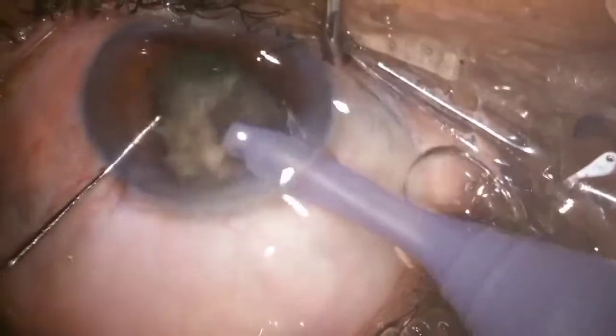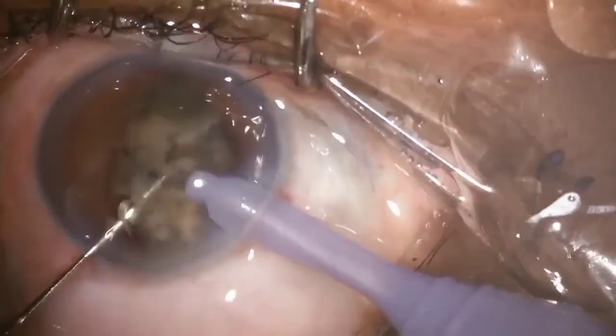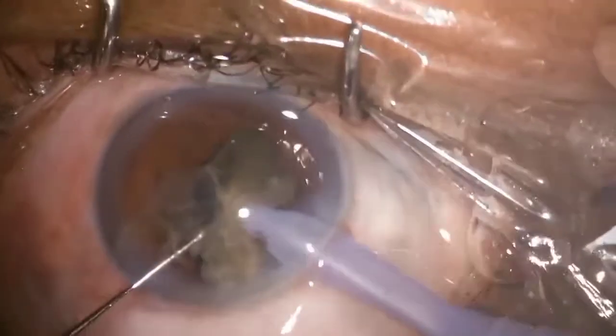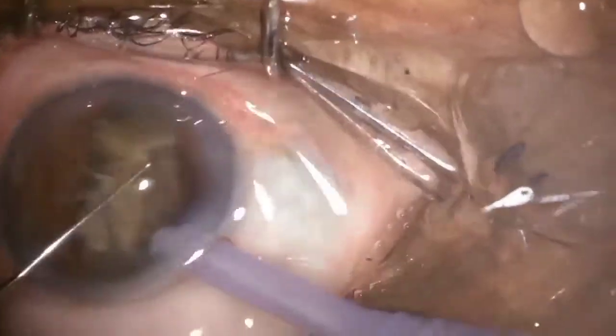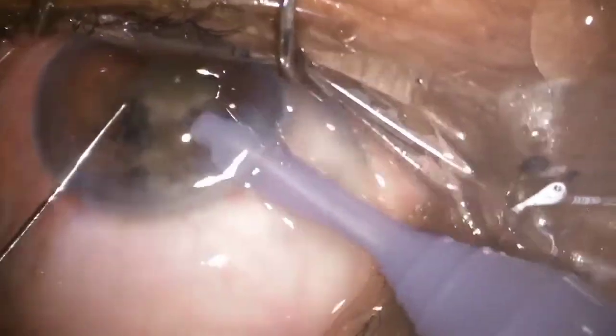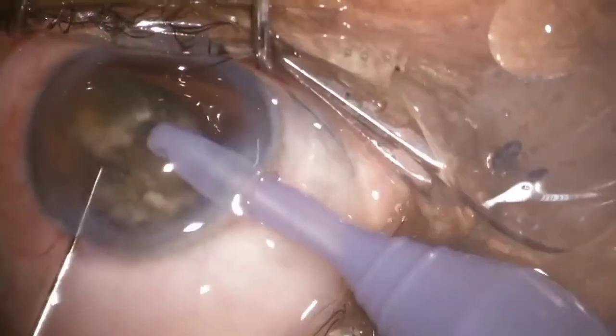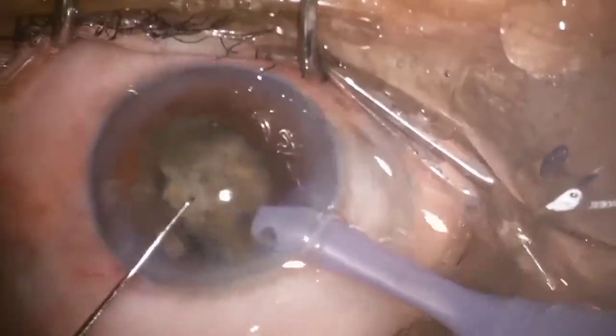I decided to do it very slowly. Slowly, I decided to crack the nucleus in the AC, and very slowly, I decided to do the Phaco in the AC. As I was applying more Phaco energy in the AC, the pupillary position was not in the primary. Also, the pupil was deviated down, and it was not in the primary gaze. So I was having fear that it may injure the PC. So with that respect, I was doing the Phaco very slowly.